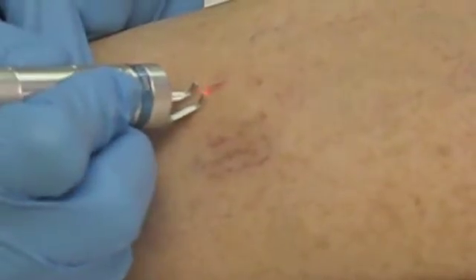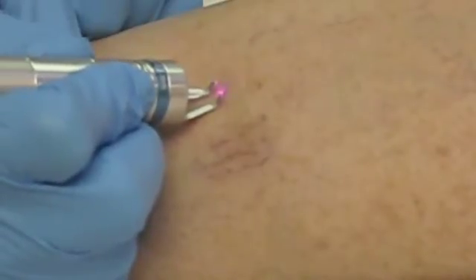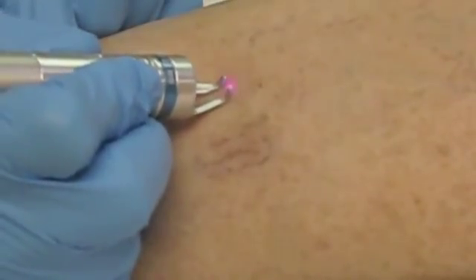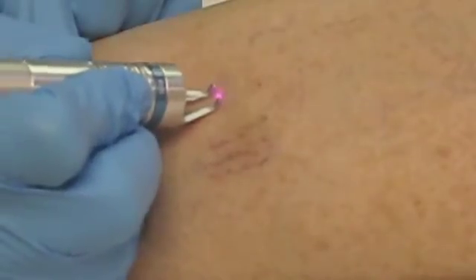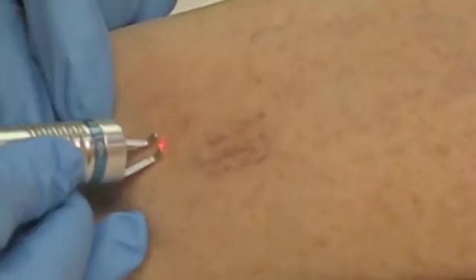You can see how that's just erasing that spider vein. Let's move on and treat another cluster. We're just getting amazing results here.